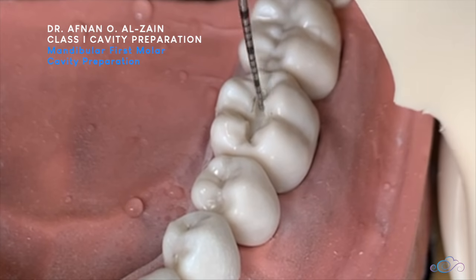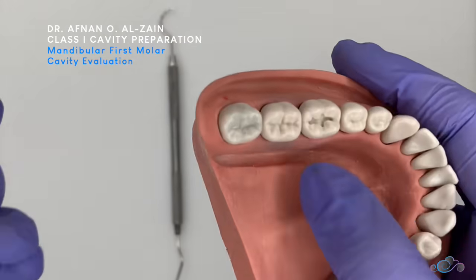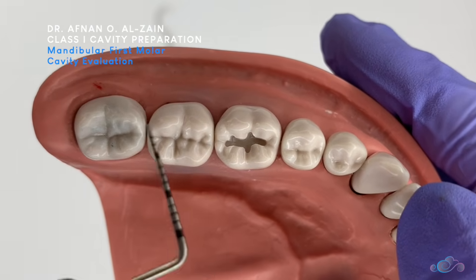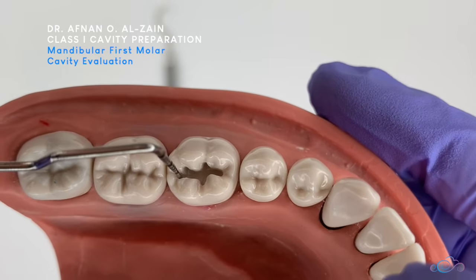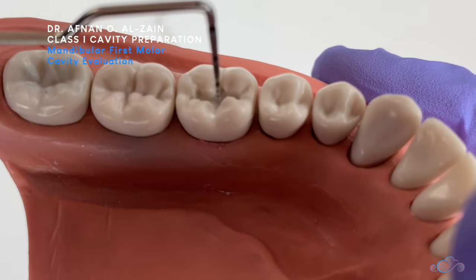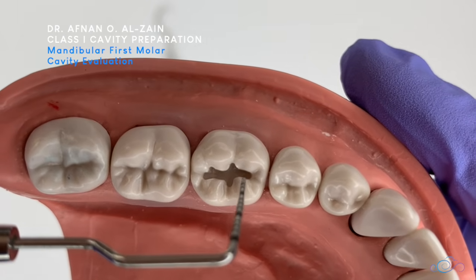We can see how it's smooth and conservative. When we look at the final cavity preparation for composite, we can see that it is very conservative compared to amalgam cavity preparation. The depth is 1.5 mm. We can see that the intercuspal distance is one quarter.